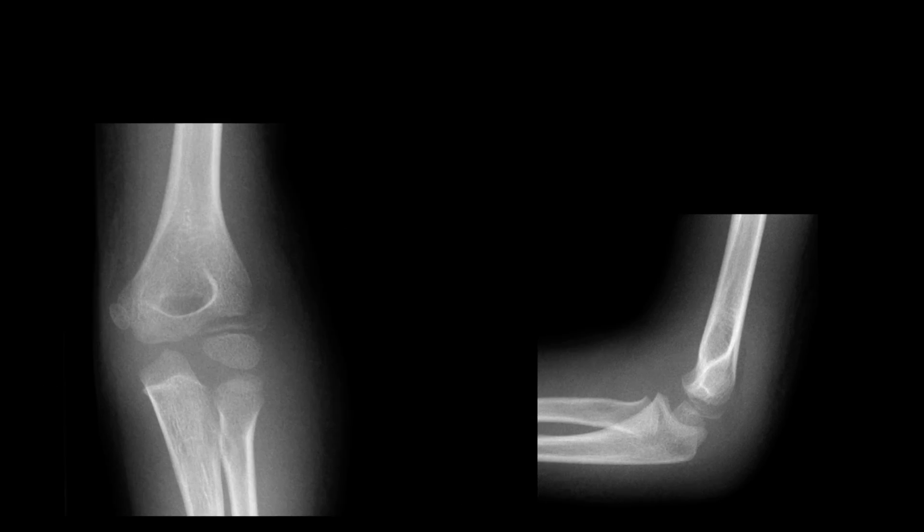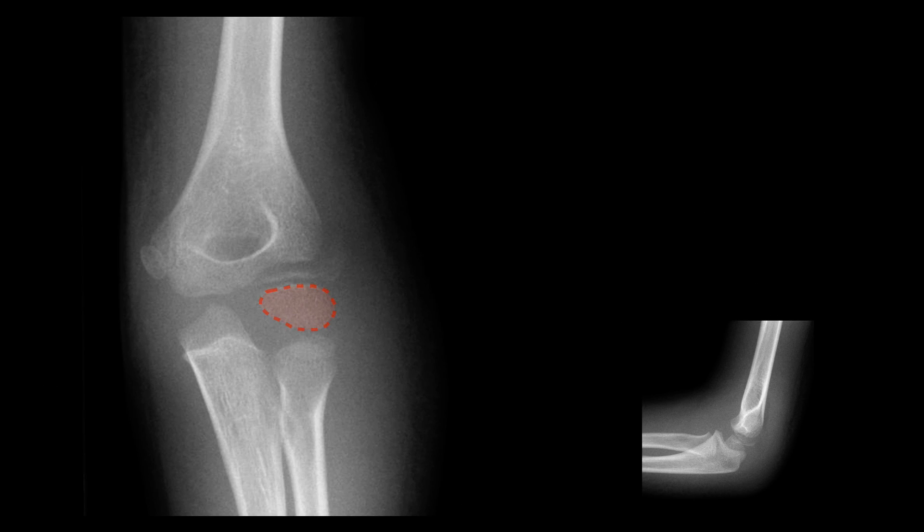On the AP we can draw in the capitellum, radial head and neck and then the radiocapitellar line. Independent of projection, the radiocapitellar line should intersect the capitellum.